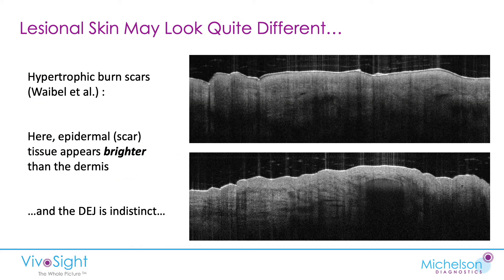Lesional skin may look quite different again. These are a couple of images of hypertrophic burn scars — I'm very grateful to Dr. Jill Weibel for these images of her patients. Here we can see that the epidermis is actually brighter in scar tissue. In the lower image, it's quite difficult to see the boundary between the epidermis and the dermis.